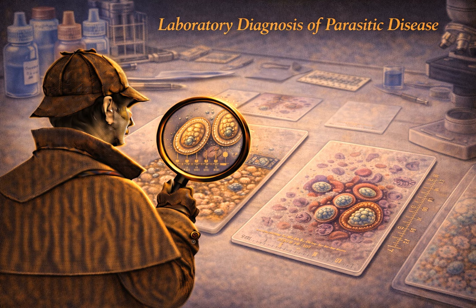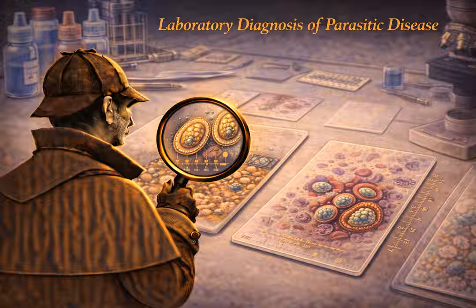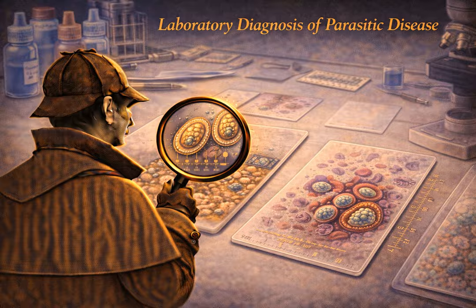The answer is that while your detection sensitivity is very high, you risk completely missing the species identification. The thick film intentionally lyses all the red blood cells, which distorts the parasite morphology. You must also have the thin film to differentiate Plasmodium falciparum, which is a deadly medical emergency requiring immediate specific therapy, from Plasmodium vivax or ovale.